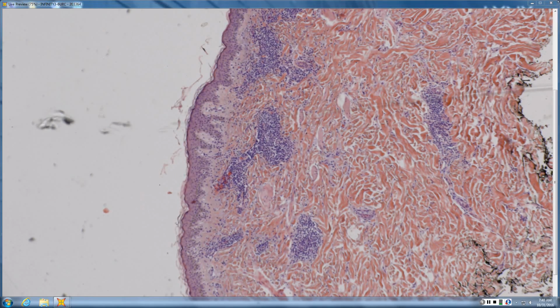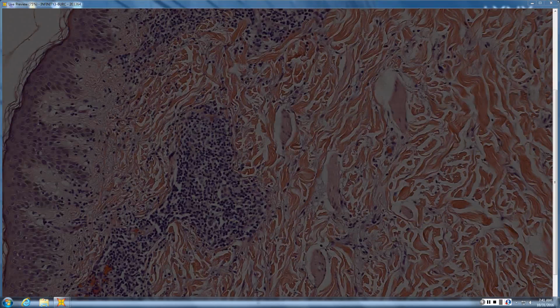In lymphoid, the same thing. T cell tends to be a triangle with the base at the bottom. B cell tends to be a triangle with the point at the bottom at the top. Okay, so those are some of the patterns that we look at in pathology. Let's look a little more here.